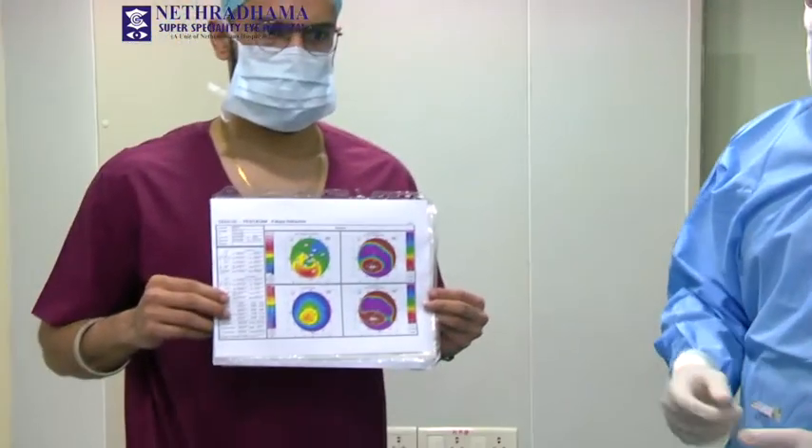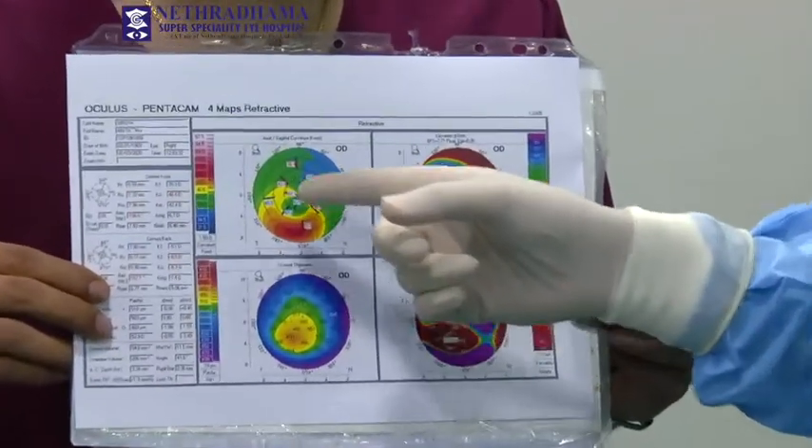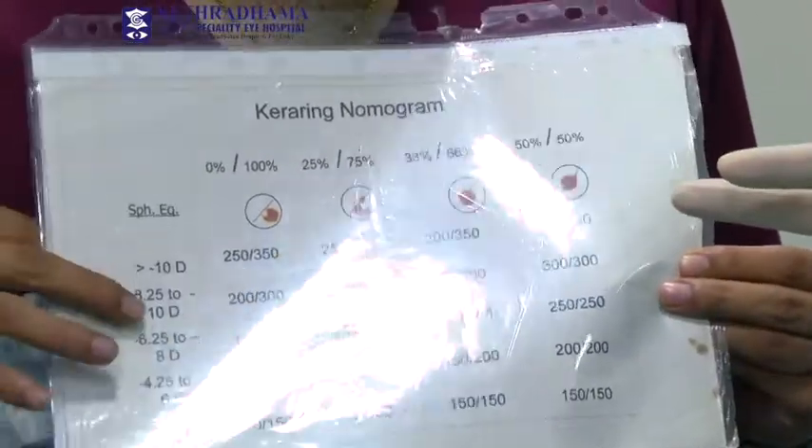If you look at the topography, this is the right eye Pentacam and you can see that there is an inferior steepening and most of the cone is shifted inferiorly.